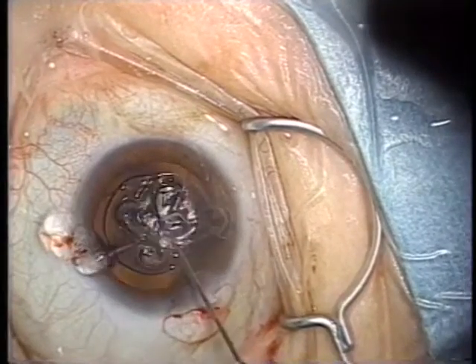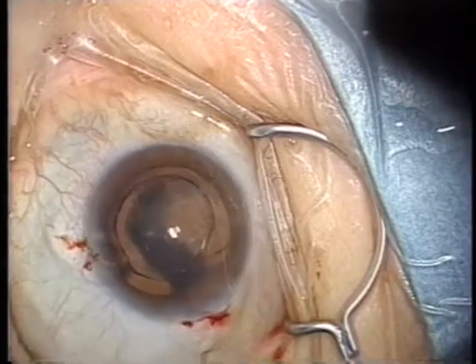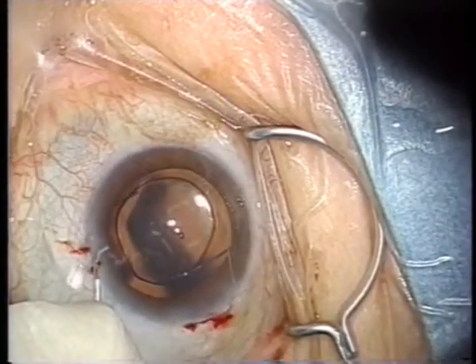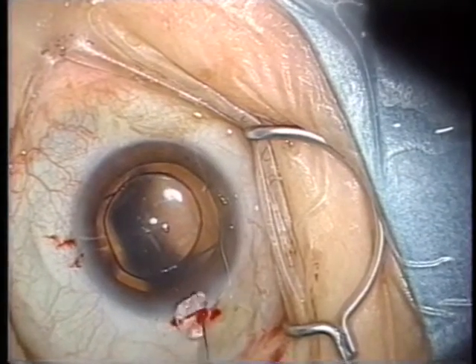As shown here in practice, the incision in the cornea and the puncture in the anterior chamber are coated with viscote before the surgery is finished. This video picture shows a slit lamp image of the cornea observed 15 minutes after the wet shell technique was performed. As you can see from this image, the layer of viscote remained on the cornea.